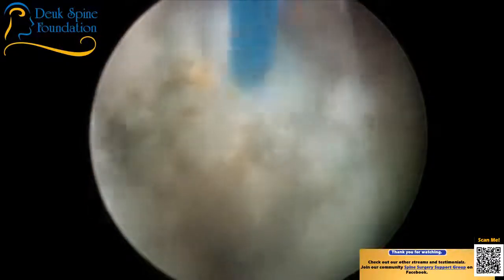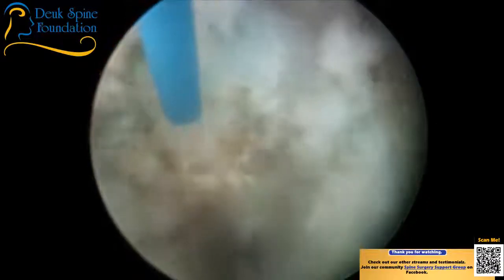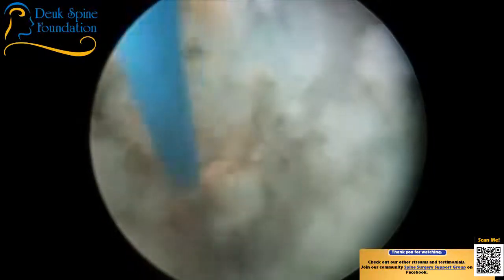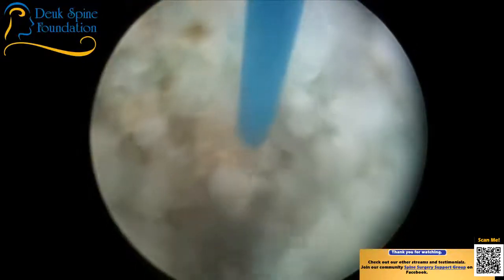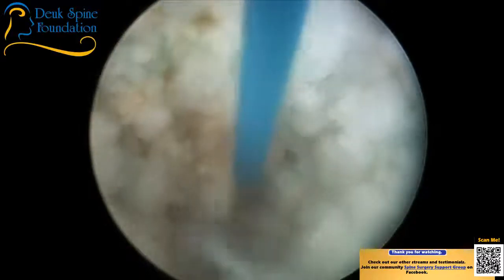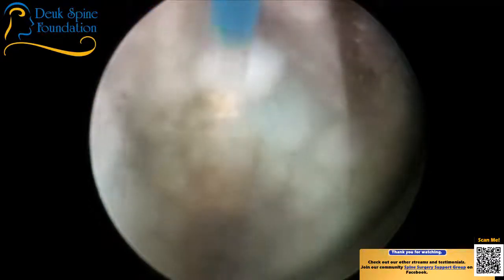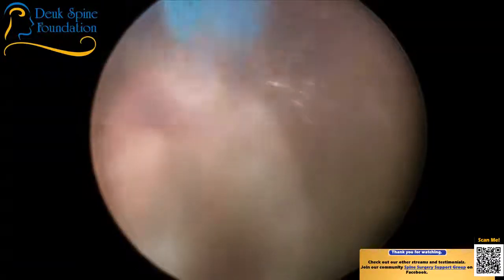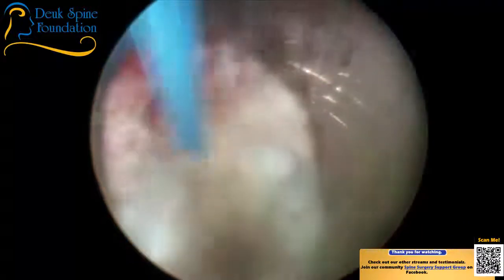This is just so scarred up right here. We call it collagenized. It means collagen. Collagen is basically scar tissue material, very white, very avascular. That's the white color. There's no blood vessels, no blood supply. And very thick, very tenacious. It doesn't zap away quickly with the laser like a herniated nucleus pulposus material. You know, the new stuff. A new herniation just zaps away within microseconds with the laser. This stuff, you have to work on it for a while.